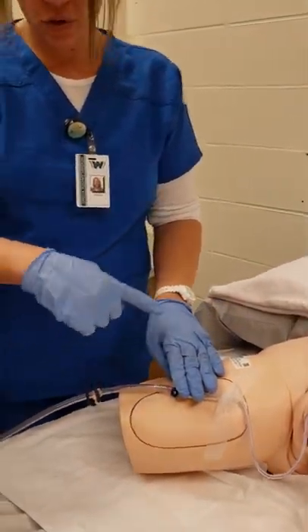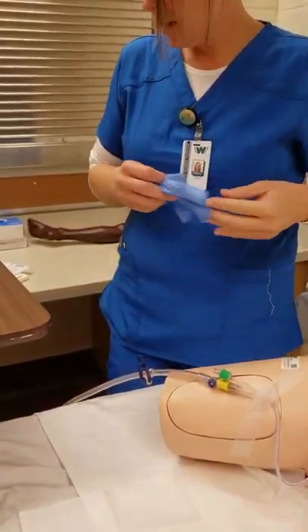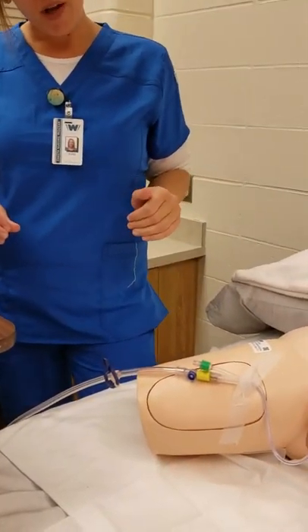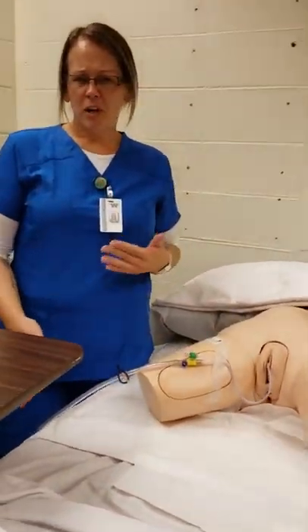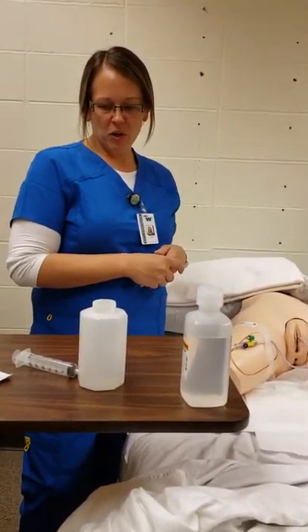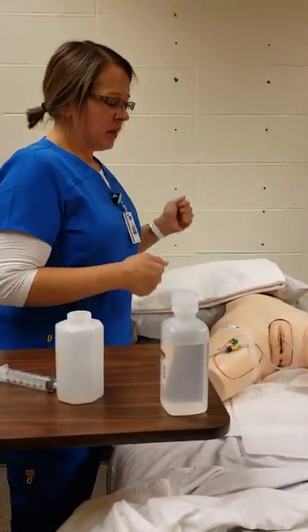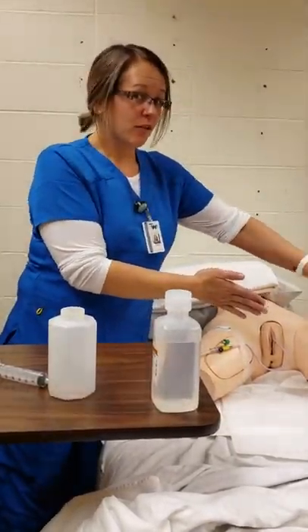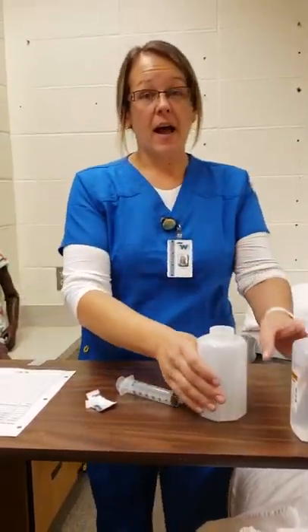At this point I release my clamp — my Kelly forceps — and the 30 mL of solution should be coming back out. I take my gloves off while watching the return and dispose of them. I document the procedure: color, clarity, how much came back out. Hopefully all 30 mL returned; if not, I would document that and notify the provider. I cover my patient back up, ensure she is comfortable, and maintain her privacy.